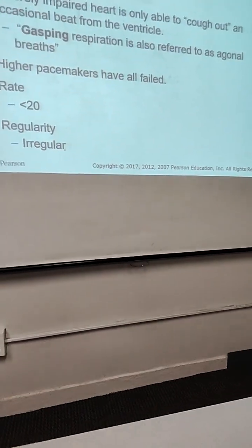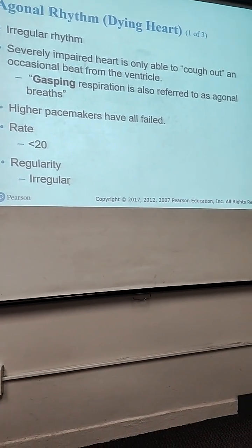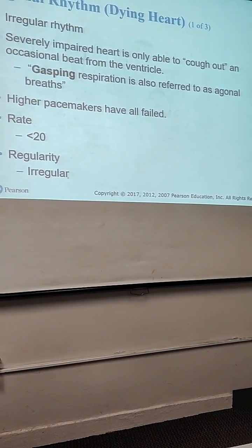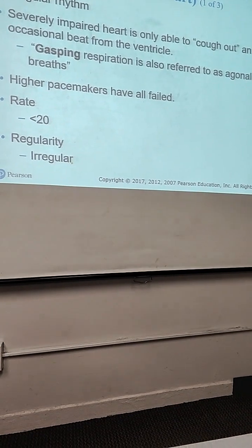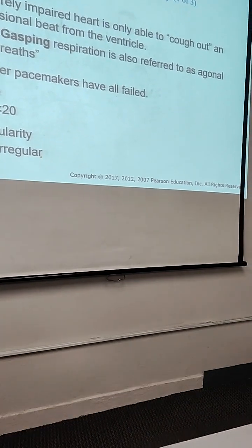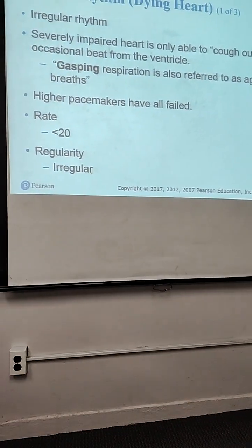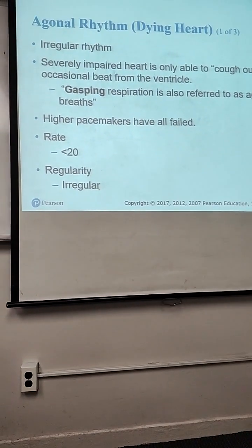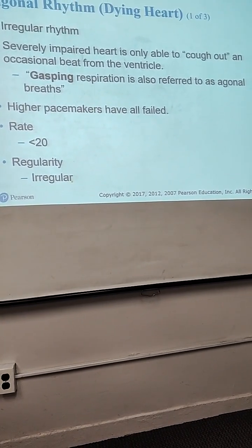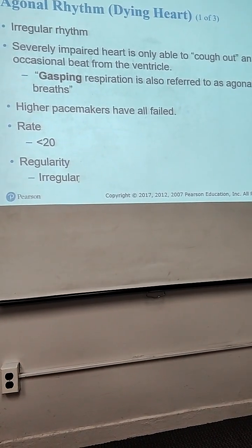Okay, agonal rhythm. Anybody heard about the word agonal? Do you have any idea what is agonal? It sounds like agony. Yes, that's exactly what it is. And what is agony? When someone is agonizing, what is it? It's dying. It's the last breaths. That's it. It's over. That's called agonal rhythm. It says dying heart.